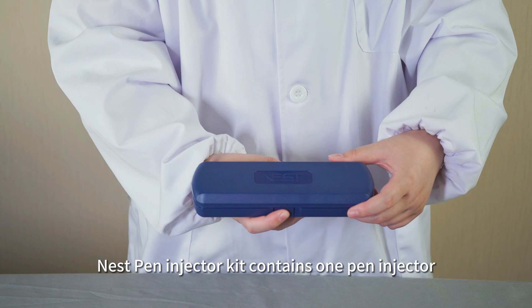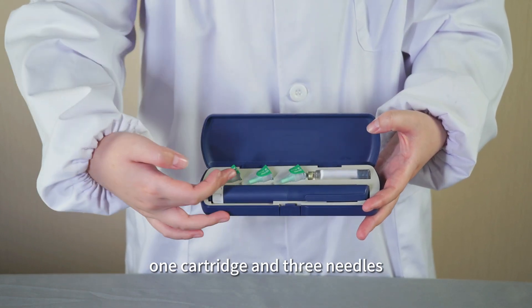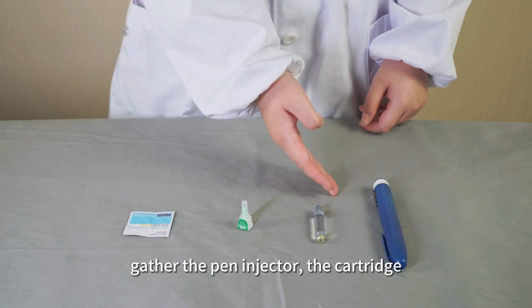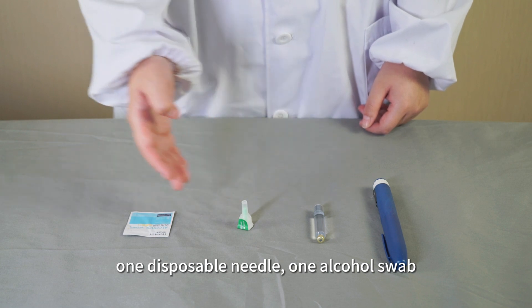The Nest Pen Injector Kit contains one pen injector, one cartridge, and three needles. Before injection, gather the pen injector, the cartridge, one disposable needle, and one alcohol swab.